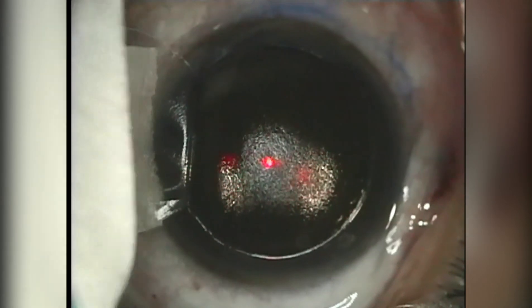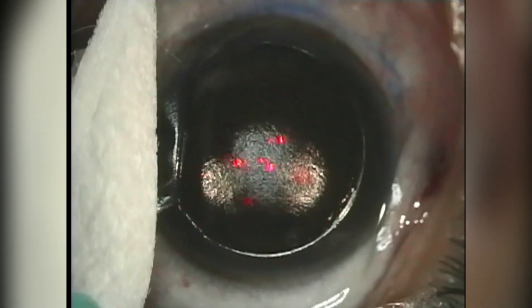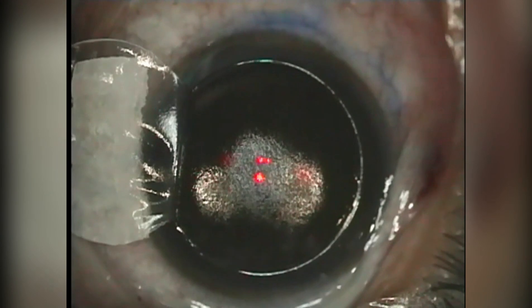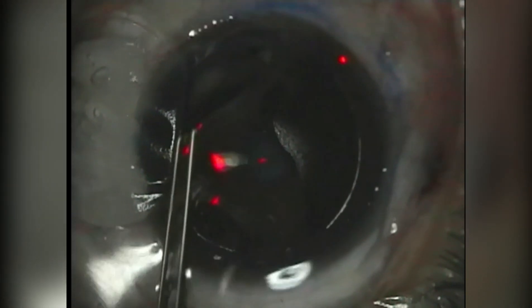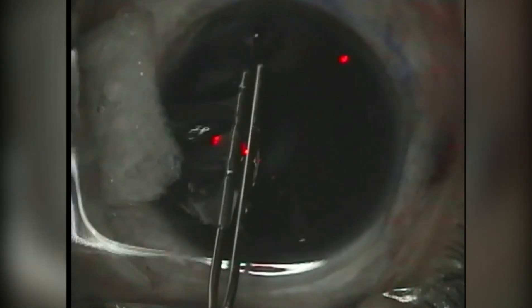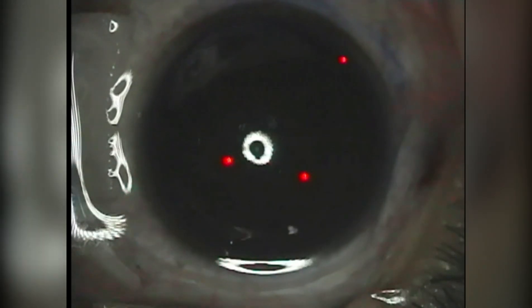LASIK surgery is designed to reshape the cornea permanently. This means that once they've undergone this life-changing procedure, many patients won't have to wear glasses or contact lenses in the decades to come. However, there are other ways by which vision may become blurred in the future. For example, another part of the eye we call the lens can get cataracts as people grow older, leading to blurring of vision mostly in the elderly — but that can be dealt with using a different procedure.